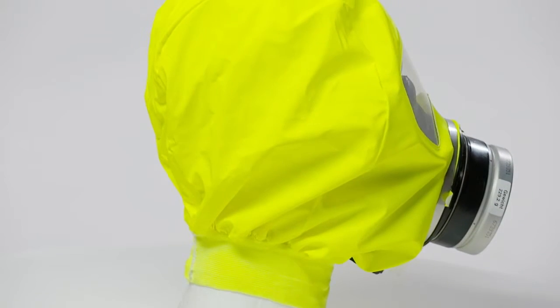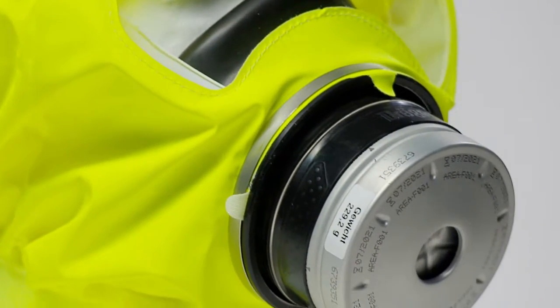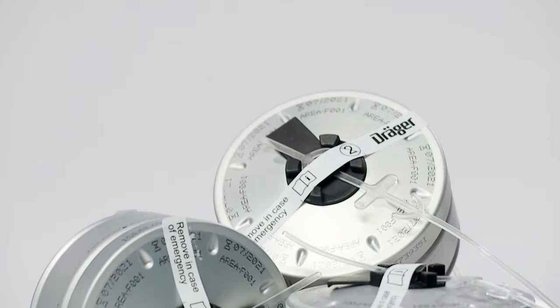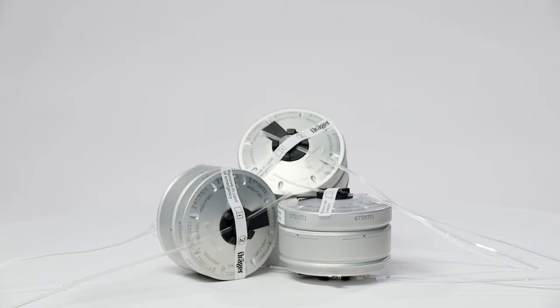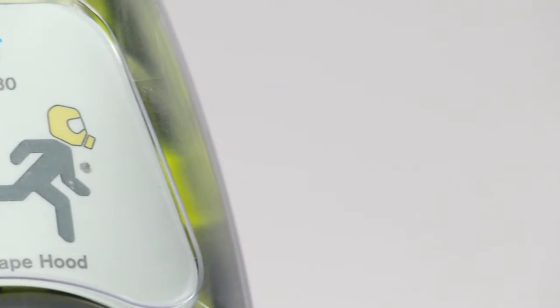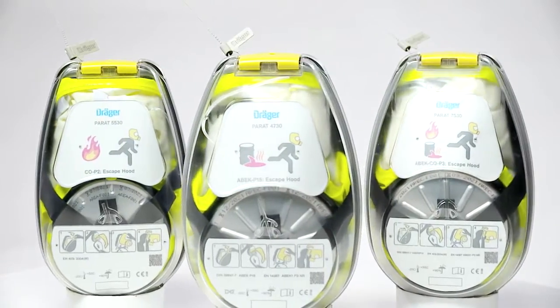Replacing the filter after 8 years will extend the service life of your Draeger-Parat escape hood to 16 years in total. Draeger offers you a filter replacement service or expert training for your employees. The filter replacement of a Draeger-Parat 5530 is shown in the following video. The same procedure applies to all Draeger-Parat hard case versions.